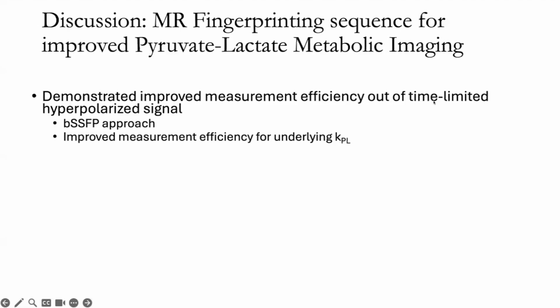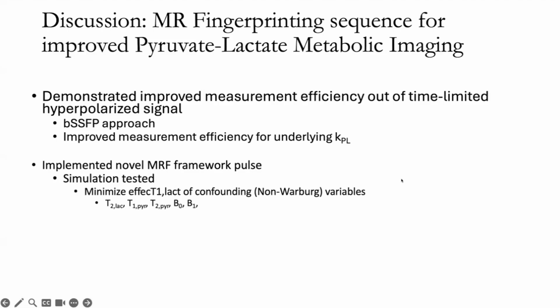Overall, to summarize everything, we've demonstrated, at least theoretically, this improved measurement efficiency out of our time-limited hyperpolarized signal using this bSSFP-based approach for KPL measurement. A lot of our simulation work was used to validate this. We also looked at the potential confounding effect of the other parameters within the signal model, specifically T2, T1 of pyruvate and lactate, B0, and B1.